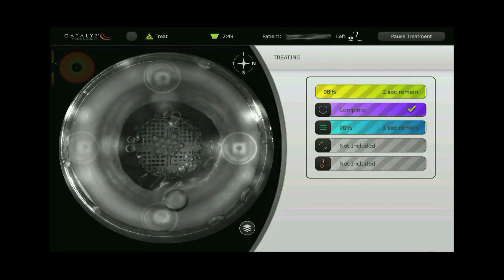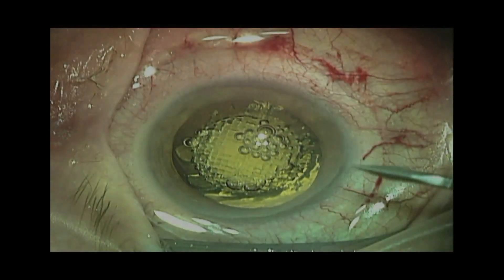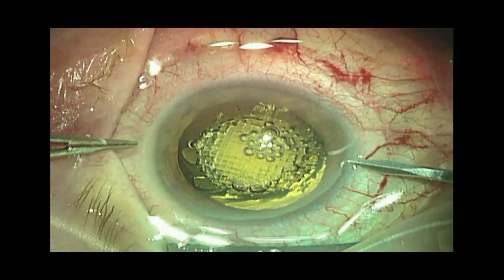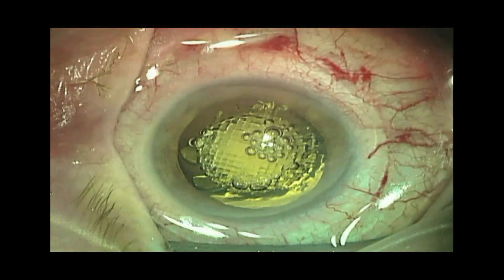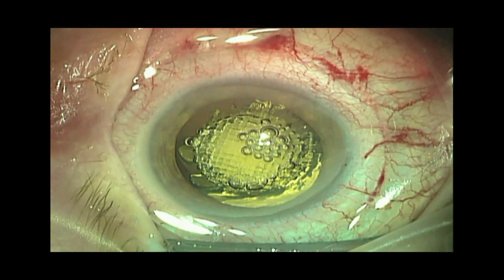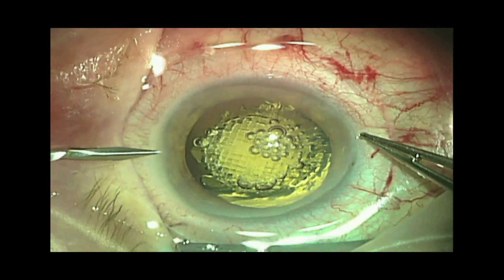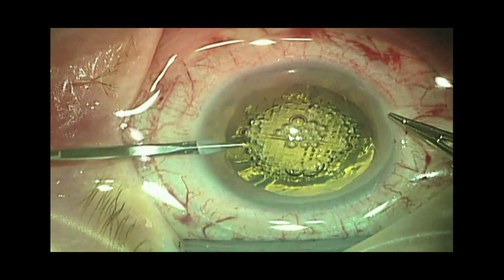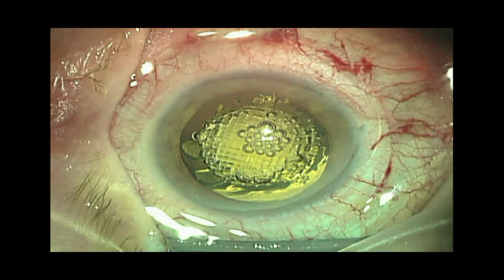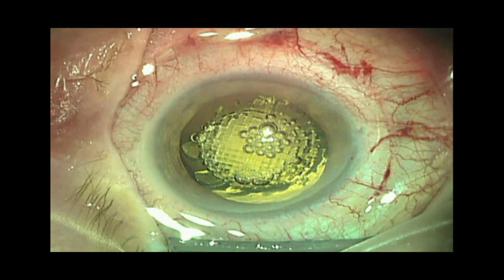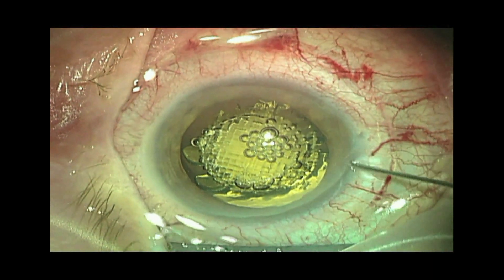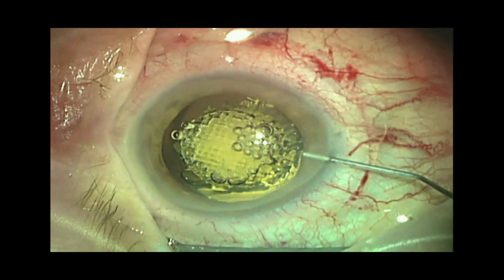The patient is undocked and rotated to the operating microscope. After creation of the paracentesis, the capsulotomy is free floating and the lens is mobile with minimal hydrodissection.